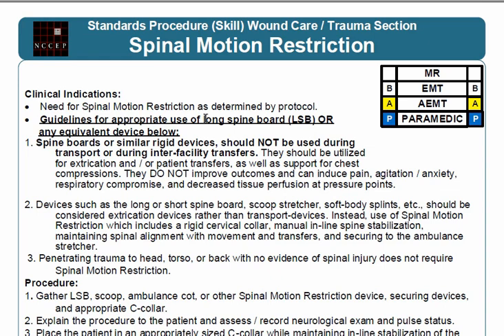Now, again, while we are using the long spine boards less, please do continue to employ the rigid cervical immobilization collars, because the main place that you're going to end up causing additional injury to a patient is if you do not appropriately immobilize their cervical spine. That's where you have more of an opportunity for motion, as the head tends to roll around and bob back and forth, but the rest of the torso tends to maintain itself in a pretty stable position once you have them on a stretcher in a supine position.